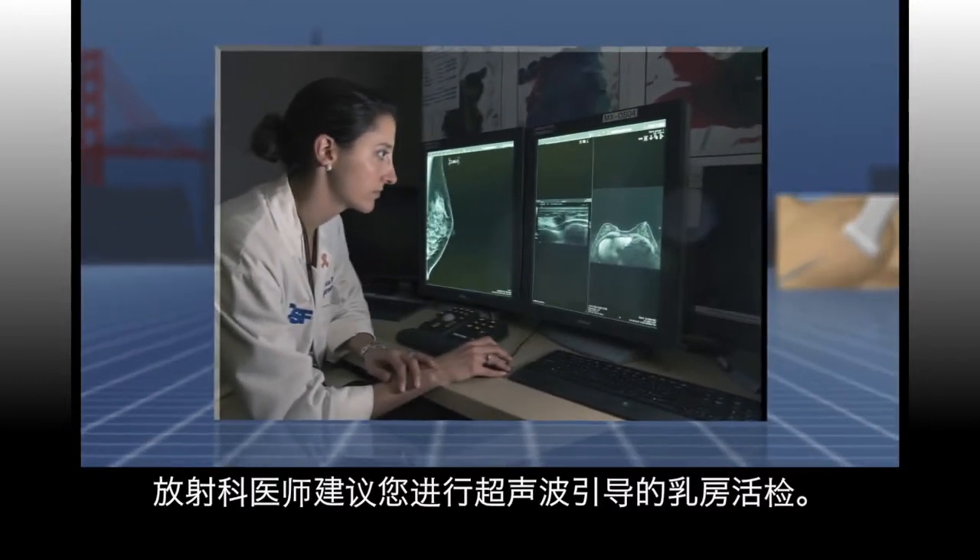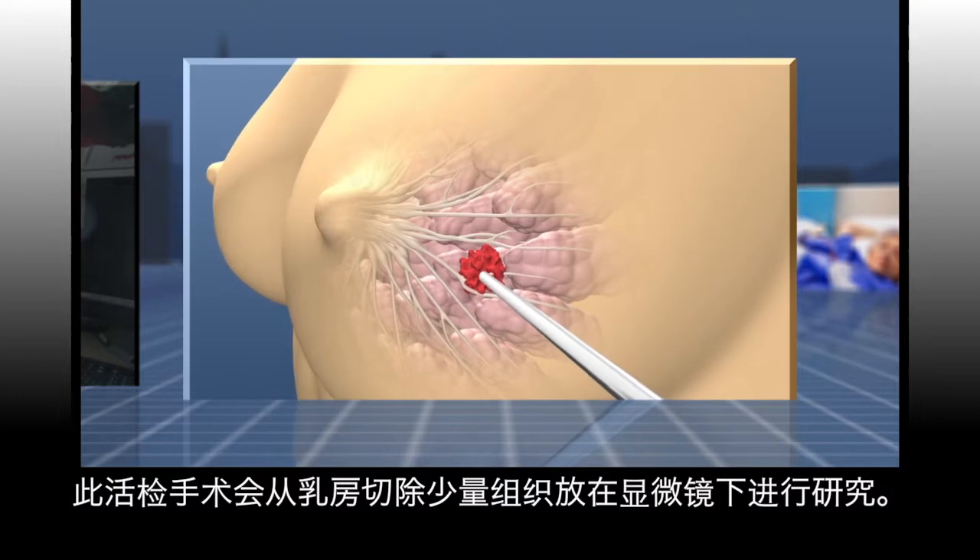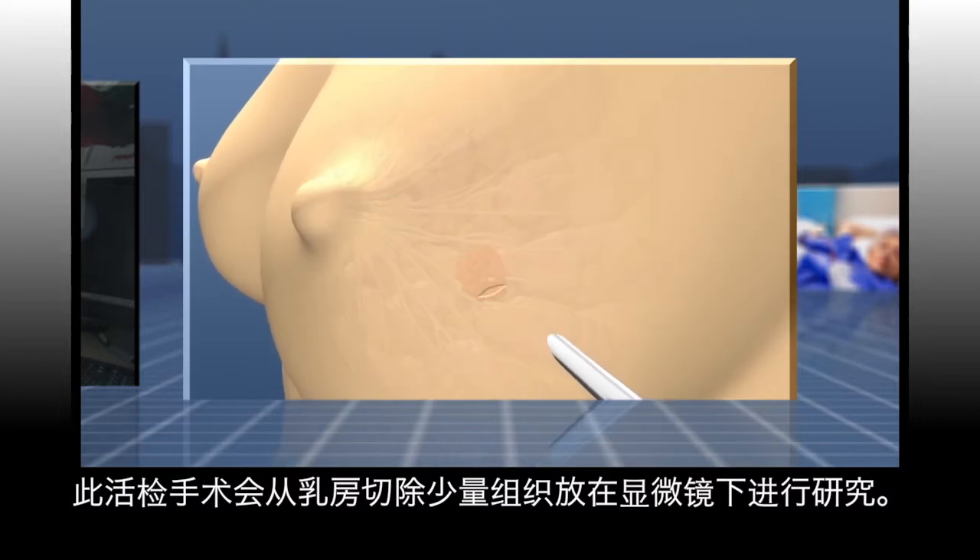Your radiologist has recommended that you undergo an ultrasound guided breast biopsy. A biopsy is when a small amount of tissue is removed from the breast to be studied under the microscope.